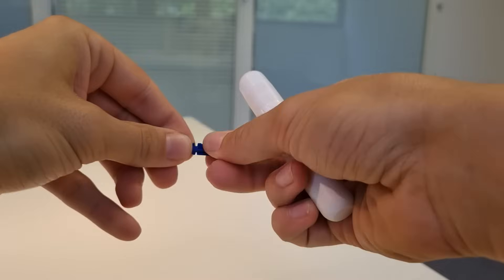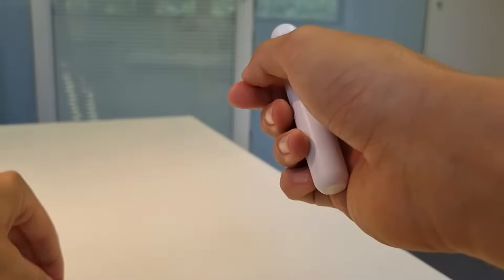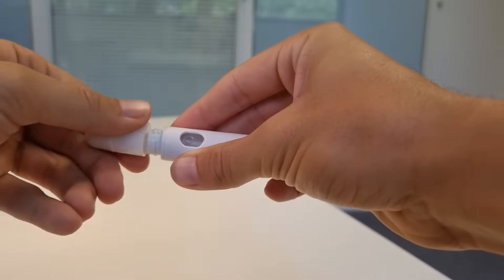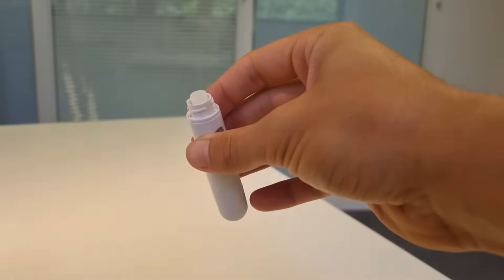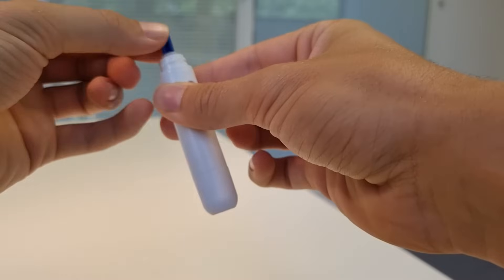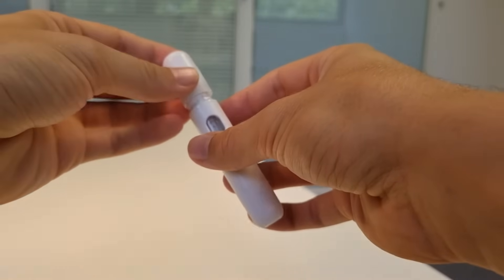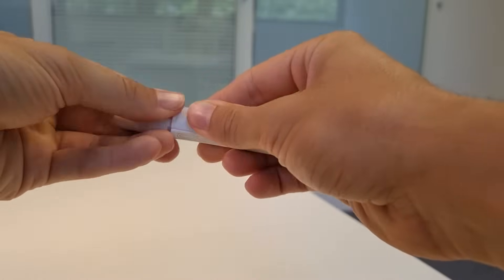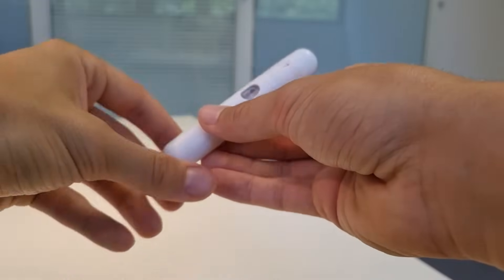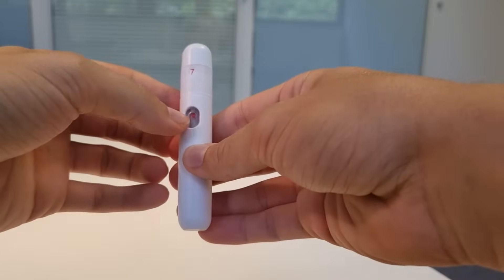Simply untwist this cap and that will expose the needle. Once you have the needle exposed you can put it to the side. On the actual lancing device, unscrew the top — that exposes where your lancet goes. You then take your lancet and place it into the slot, and then you can replace the cap. To load the lancet, pull this back until you hear a click, and then your lancet is ready to go — you'll know that because there'll be a red symbol.